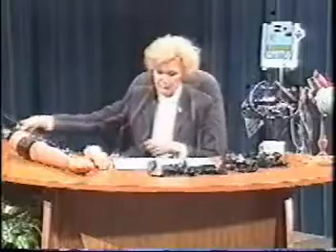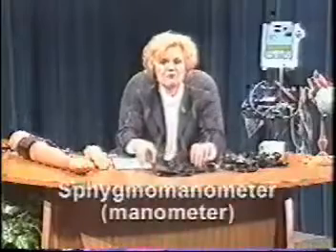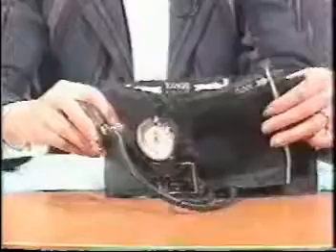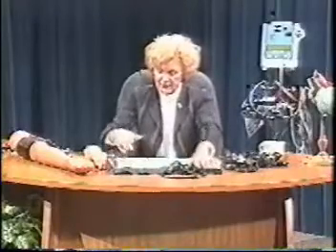Besides the stethoscope, we have another apparatus. This is called the sphygmomanometer. Awfully long word, sometimes shortened up by being called a manometer. And a manometer consists of a cuff, and this is the cuff portion of the sphygmomanometer, just this portion. And inside this cuff is a rubber tube, a rubber cuff that air goes in. It's much like a balloon, and it inflates around the individual's arm.